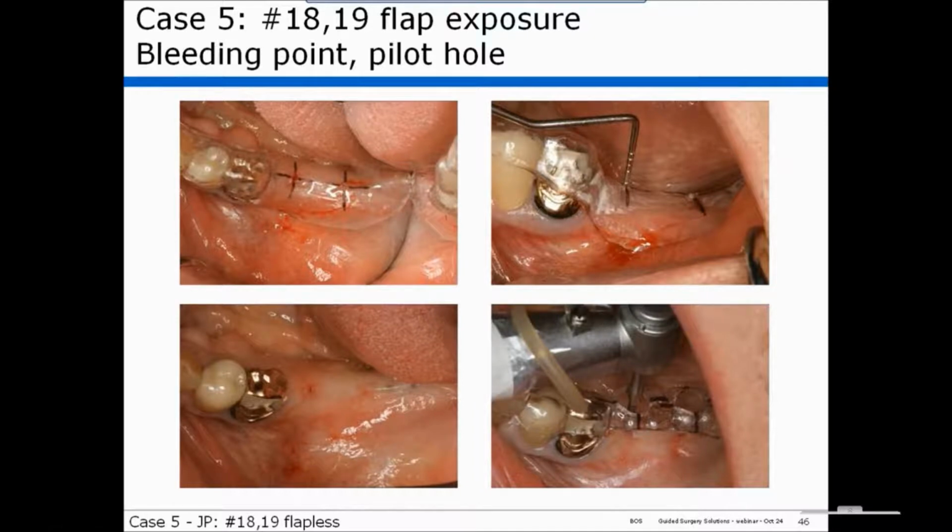So you could really set everything up for the dentist and just give them the case ready for treatment planning? Yes, pretty much.